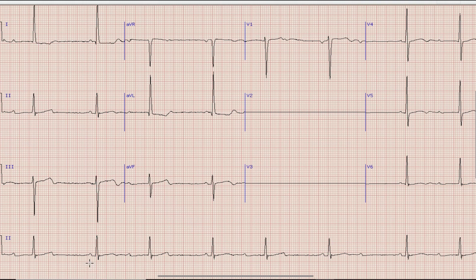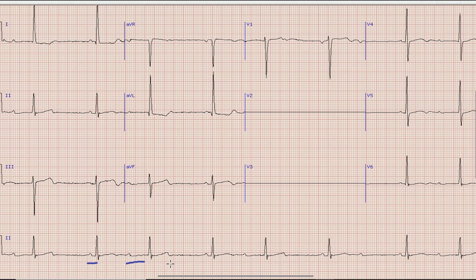If you note the second QRS complex in the rhythm strip, you can see a normal PR interval before this QRS complex, while the next PR interval is significantly prolonged. After that, the P wave is hidden within the T wave and there is no QRS complex after that P wave.